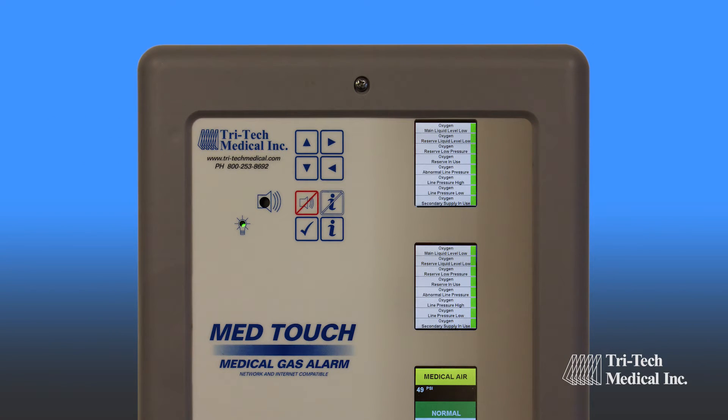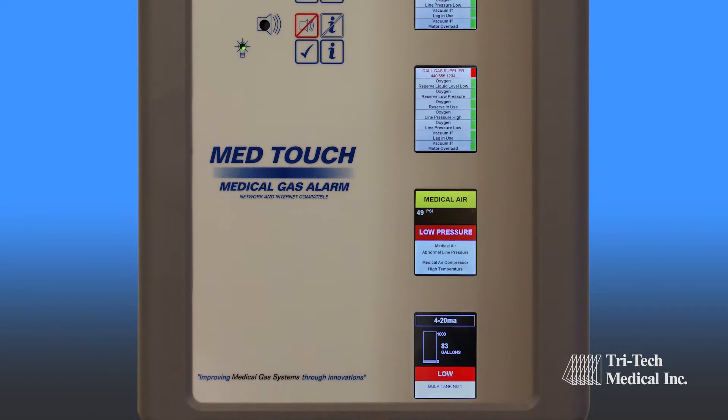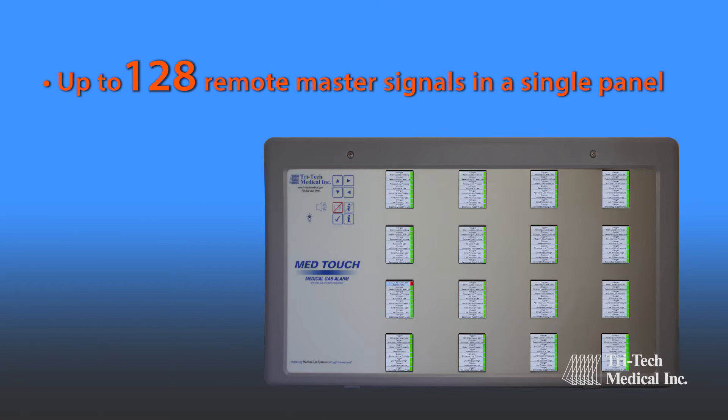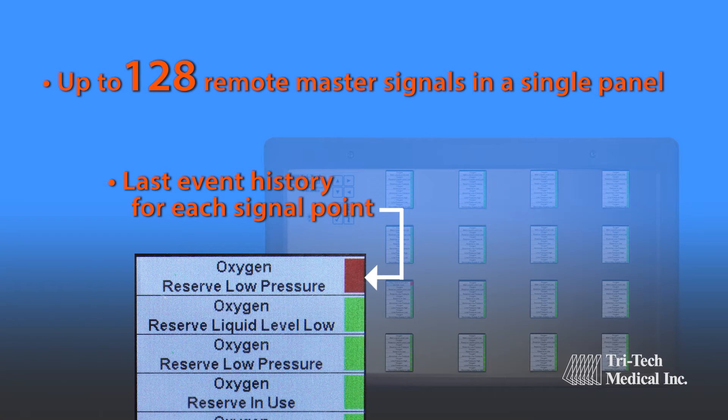All modules have visual normal and alarm indicators in addition to audible alarm indicators. Up to 128 remote signals may be incorporated in a single panel. Last event history is provided for each signal point.